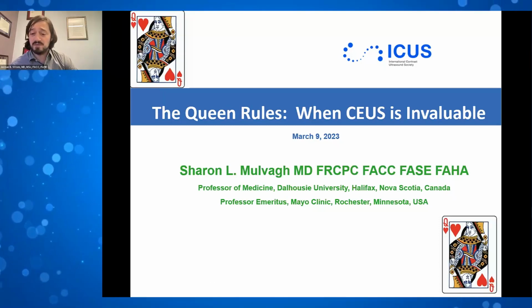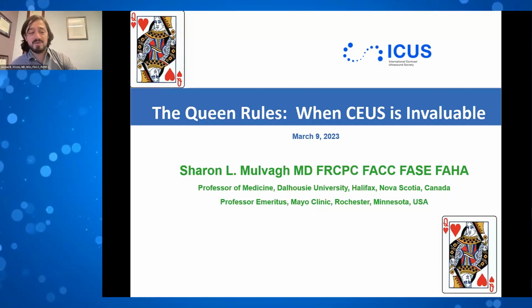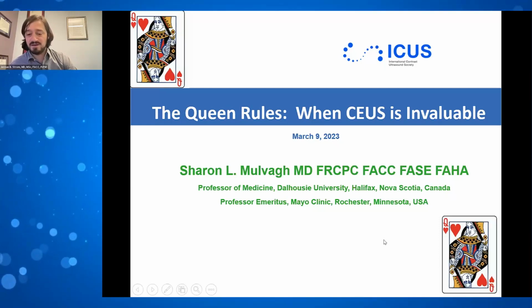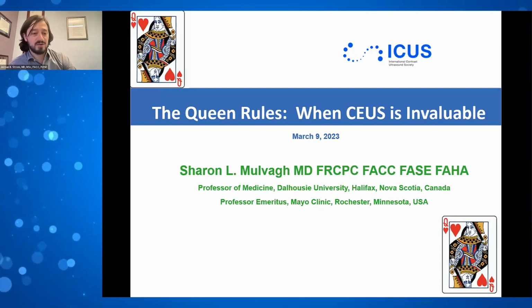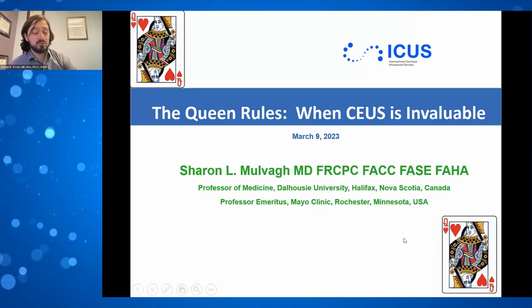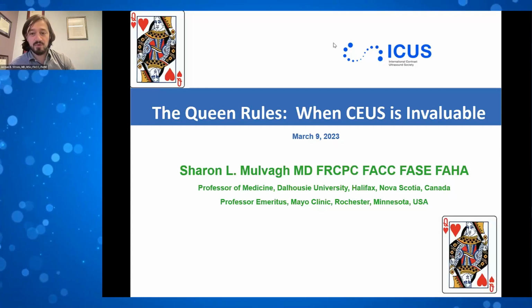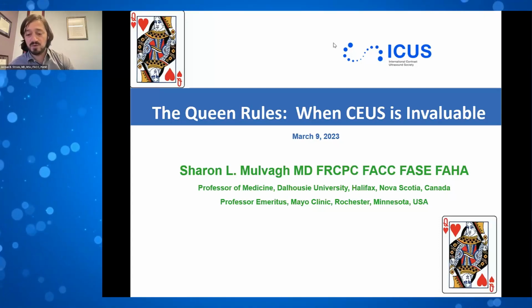Part of it is unfamiliarity. People don't necessarily have training on contrast use, and they may be unfamiliar, and they don't have advocates within their lab or others. Really importantly, you really need an advocate within your center or site to be able to drive use of this and to be able to champion use across the medical center. And so part of it is where people trained. It's force of habit, and it may be a consequence of where ultimately people trained, and if they were exposed to contrast use in their training site and what they're used to doing or not doing.